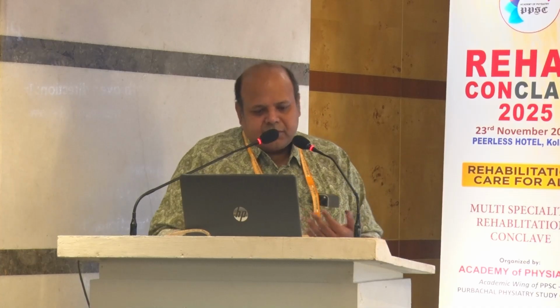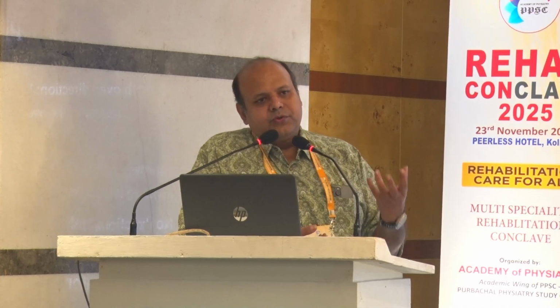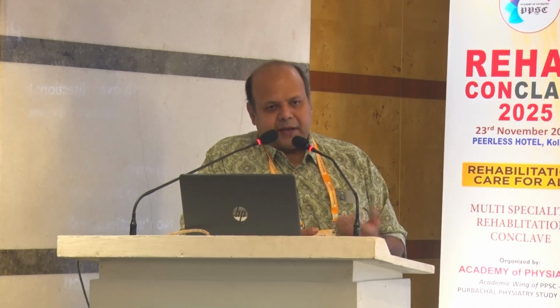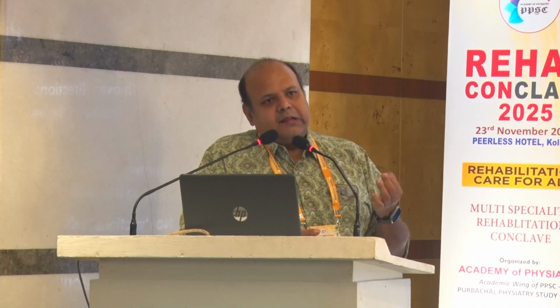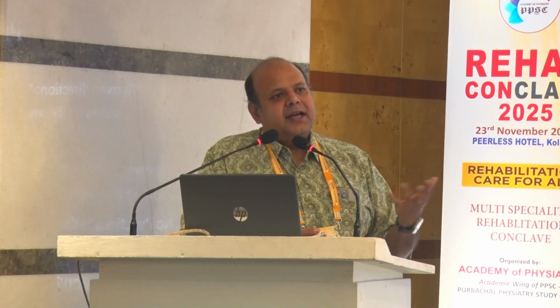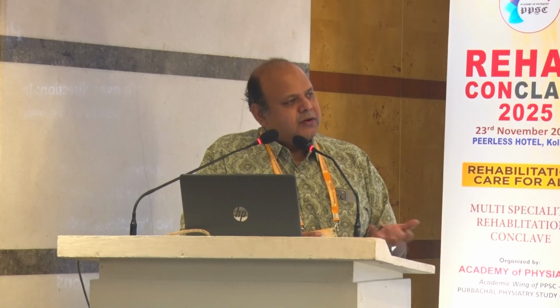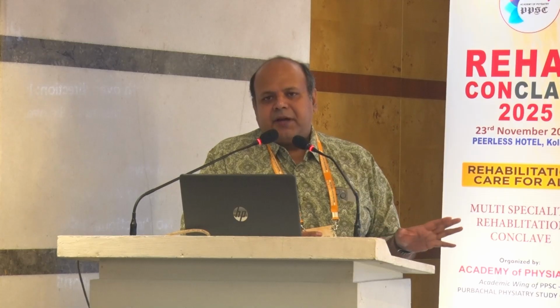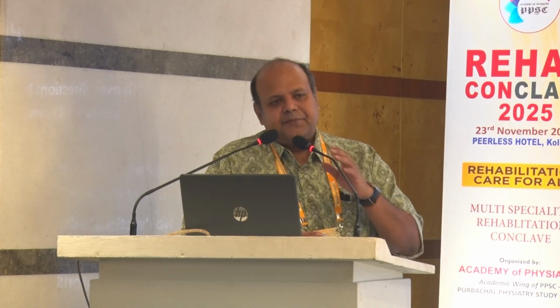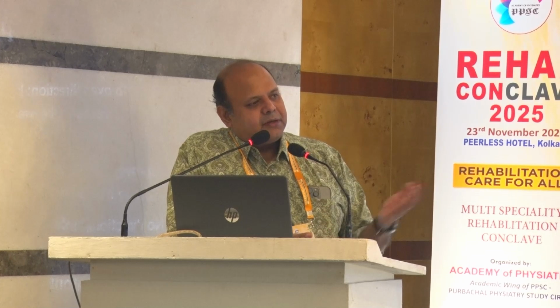A few words about power Doppler. Power Doppler is used for small, low flow vascular imaging, in cases of small joint arthritis and neovascularization. These are independent of the flow direction. The usual Doppler is dependent on the flow direction, but these are independent, and they pick up very low flow.